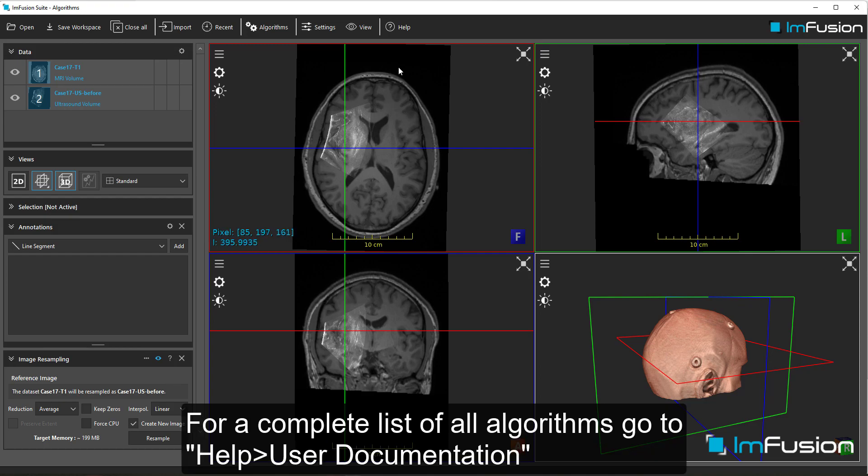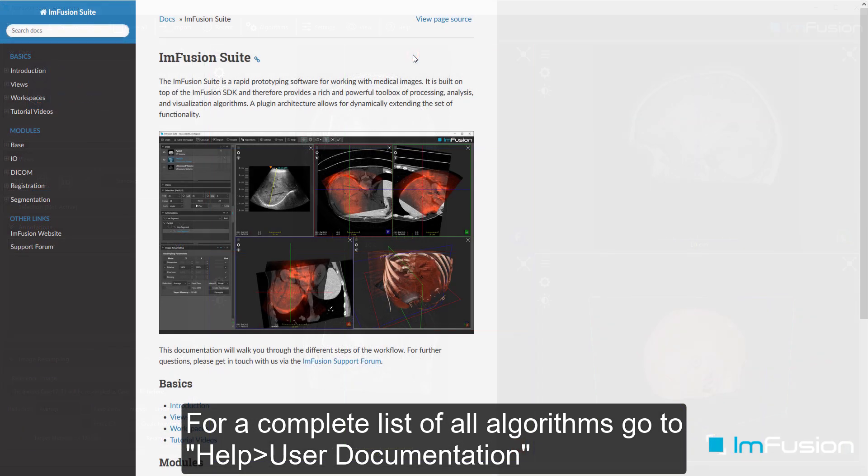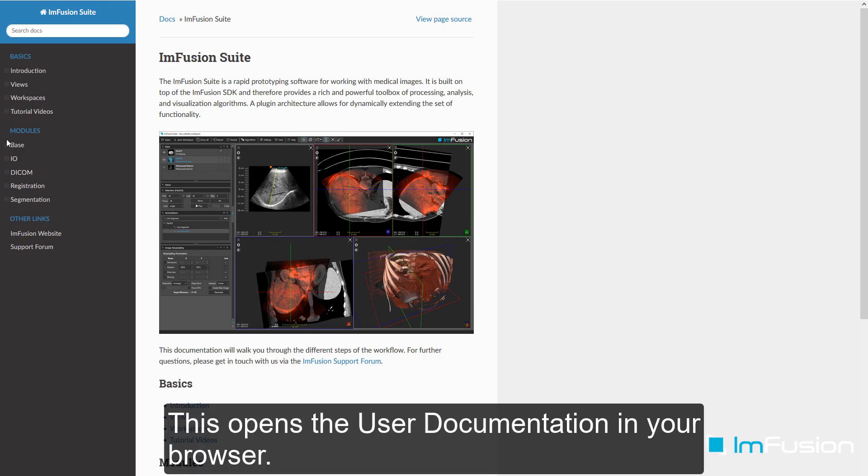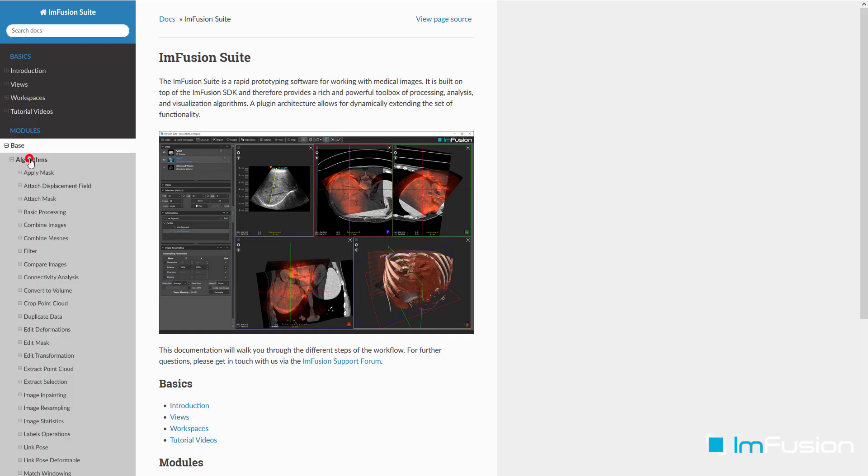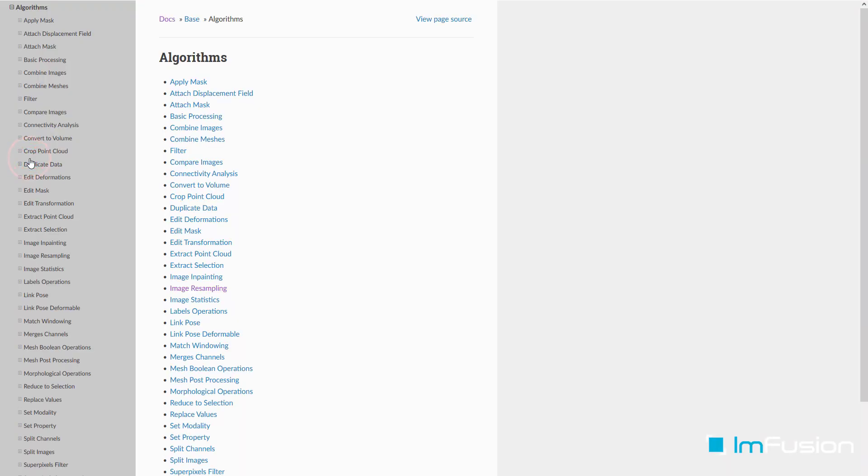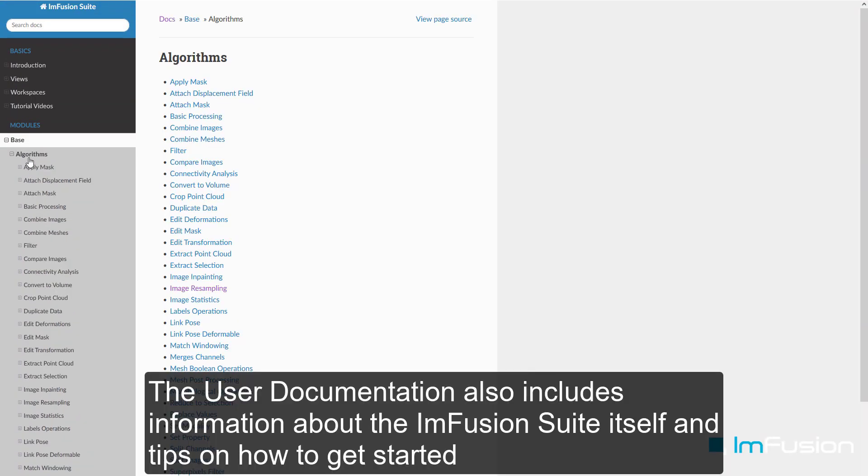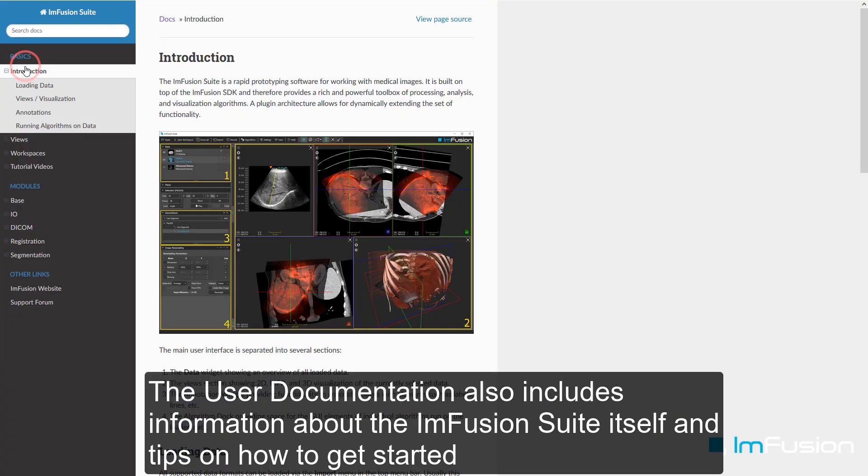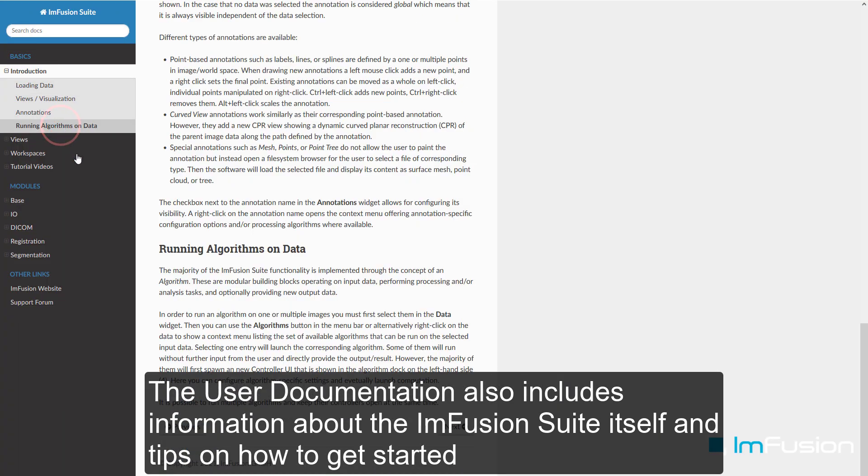For a complete list of all algorithms, go to Help User Documentation. This opens the user documentation in your browser. The user documentation also includes information about the ImFusion Suite itself and tips on how to get started.